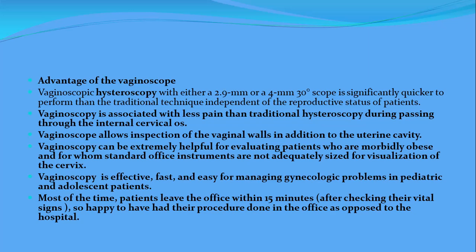Vaginoscopy is effective, fast, and easy for managing gynecologic problems in pediatric and adolescent patients. Most of the time, patients leave the office within 15 minutes, after checking their vital signs, so happy to have had their procedure done in the office as opposed to the hospital.